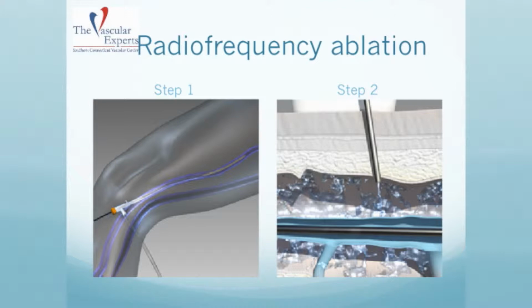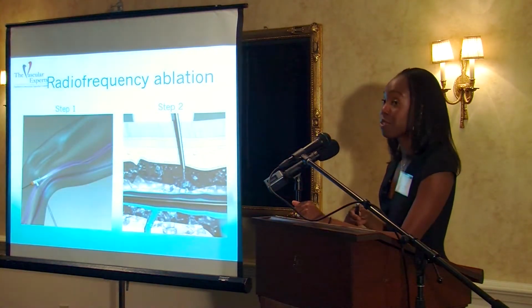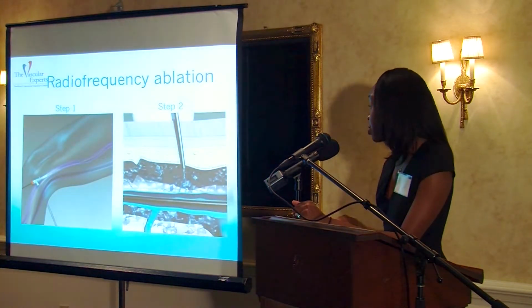Step one, you can see that there's a sheath already here. What's pictured is the great saphenous vein, so it's a percutaneous treatment. The sheath is placed, and then the radiofrequency catheter is placed through the sheath up to the furthest point of treatment. In the great saphenous vein, it's approximately 3 centimeters prior to the saphenofemoral junction.